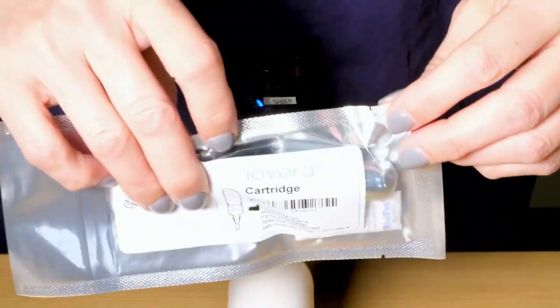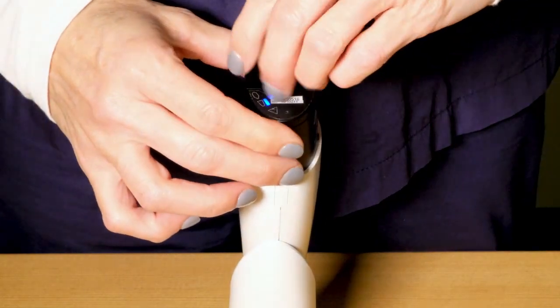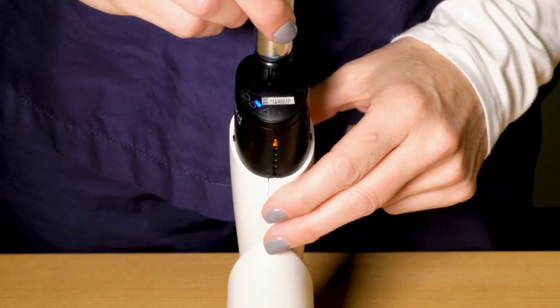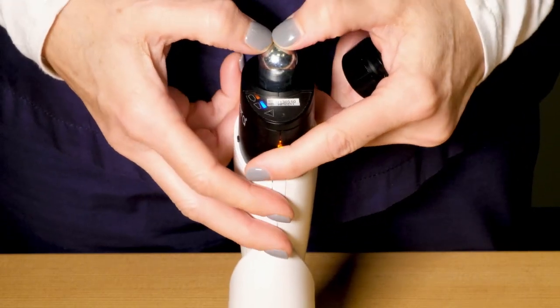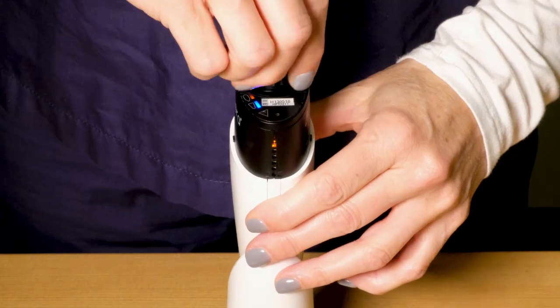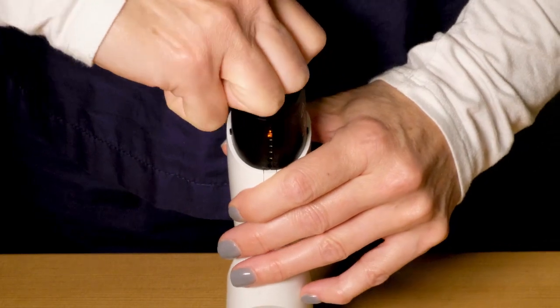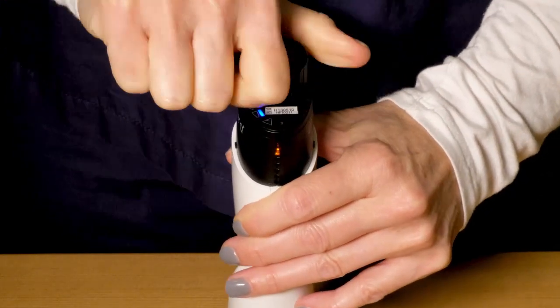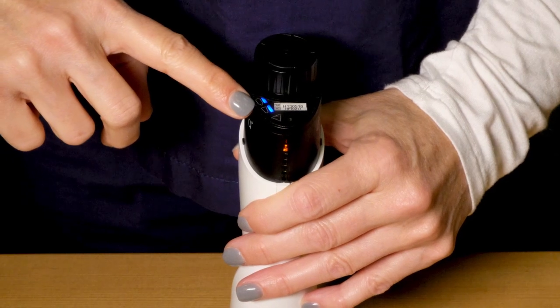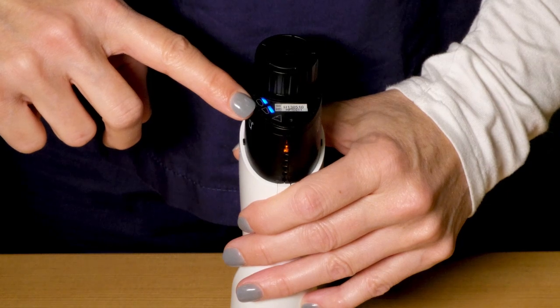Remove the iOVERA nitrous oxide cartridge from its pouch. Remove the cartridge cap and insert the cartridge until you feel a click. Tighten the cartridge cap until the cartridge indicator LED pulses blue. The LED will turn solid blue when the cartridge is ready and the device will make a noise.